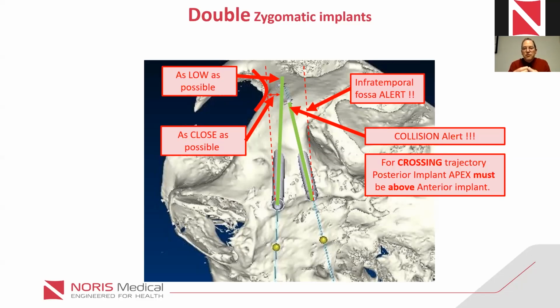So this is why it's very important to have a very rigid construction. The best thing would be to have a splinted bar, not just to put the T-bases in acrylic. It's not strong enough, maybe for temporaries, but it's not strong enough. The best would be to have a rigid bar.